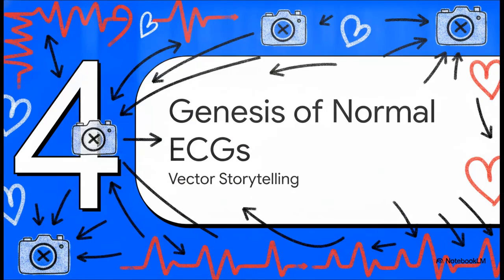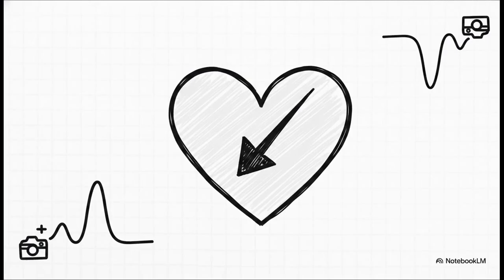Which brings us to Section 4, the genesis of normal ECGs, or what I like to call vector storytelling. This is where it all really comes together. We're going to combine our waveform alphabet with our camera angles using vectors, basically arrows that represent the mean direction of the electrical spread. So the crucial point is how these vectors completely dictate the shapes on the paper. Let's take the atria first.